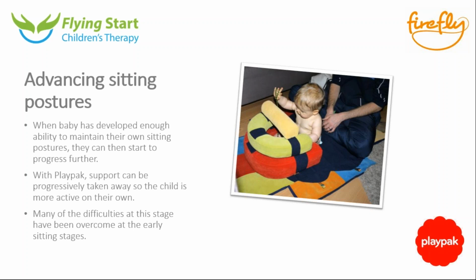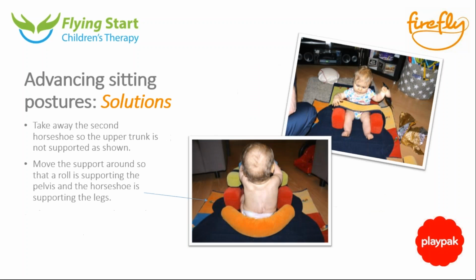To move on to these positions, you really do need to have head control and trunk control. The beautiful thing about the Playpak is that it's so versatile with how much support you can give. You can start off with those early positions and then transition so that you can develop forward-facing sitting by taking out the top horseshoe, then maybe the top strap, then the bottom strap, so that they're still sitting forwards in that early posture, but gaining less and less support. Once they're at that level, then you can really start to have fun and mess around with things. So we've overcome a lot of the early difficulties in actually sitting by the time we're reaching these advanced sitting postures. If we go on to the next slide.